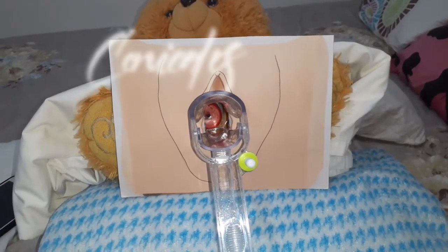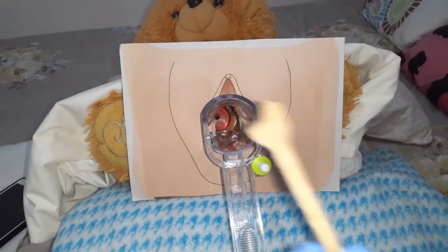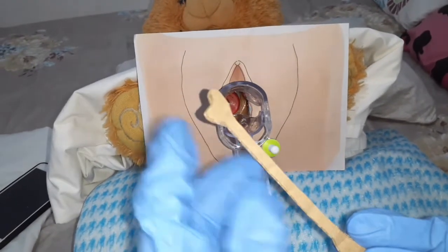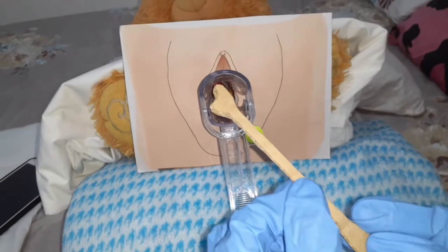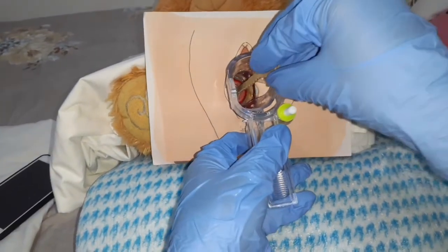Now for the cervical OS specimen. Get a cervical spatula. Let's assume this is my cervical spatula. Insert this through the speculum. Insert the uneven side of the spatula onto the OS of the cervix. Gently rotate. That's the cervix.